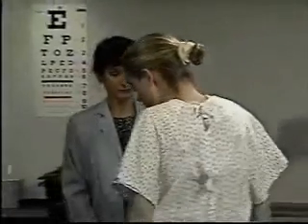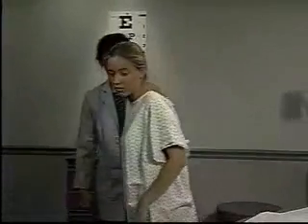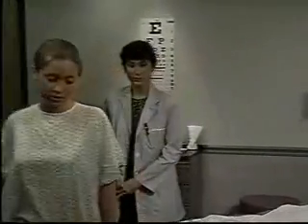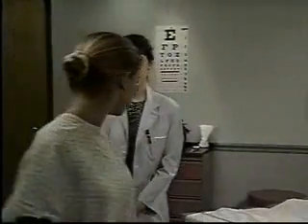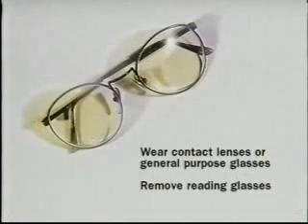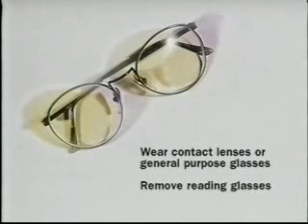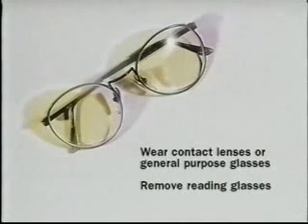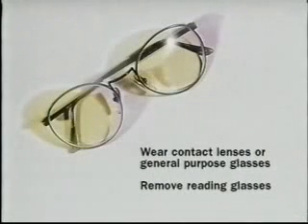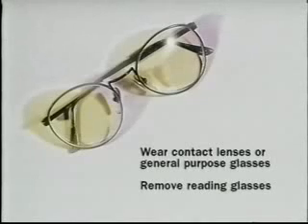Begin the eye examination by assessing the patient's visual acuity. Have the patient stand 20 feet from a Snellen eye chart. If the patient wears contact lenses or general purpose glasses, tell her to wear them. But ask the patient to remove reading glasses because they blur distance vision.